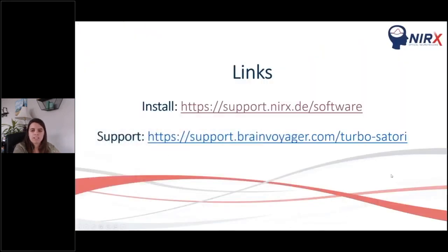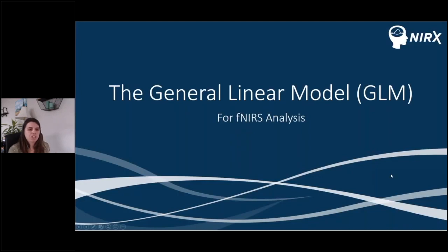Okay, coming back to the presentation, I'm going to switch gears a little bit, and now we're going to talk about fNIRS analysis. So I really want to go through the critical fNIRS analysis concepts, which will set us up and make sure that we know exactly what we're looking for when we get to the software. So I'm just going to quickly review the general linear model, which is commonly used for fNIRS analysis.